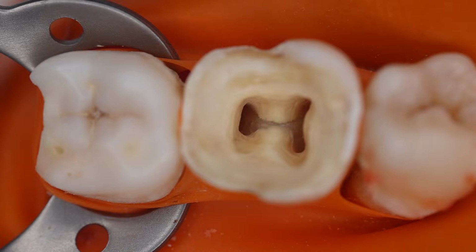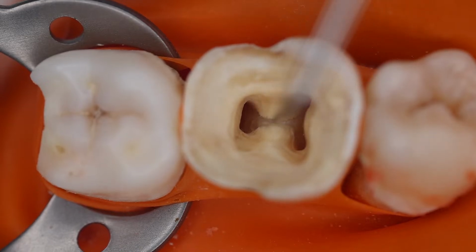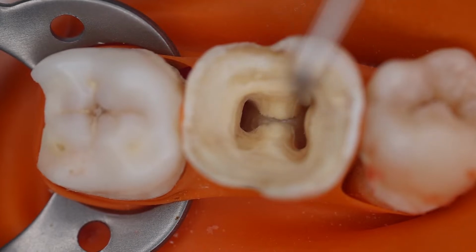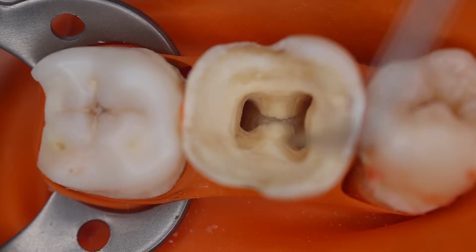In the previous session we were able to do the access cavity preparation for this grossly carious mandibular molar, and we could identify the canal orifices. This is the distal canal orifice, a single large distal canal orifice. Then the dentinal map is leading us to the mesobuccal canal orifice and the mesolingual canal orifice. So these were the orifices that we were able to identify.